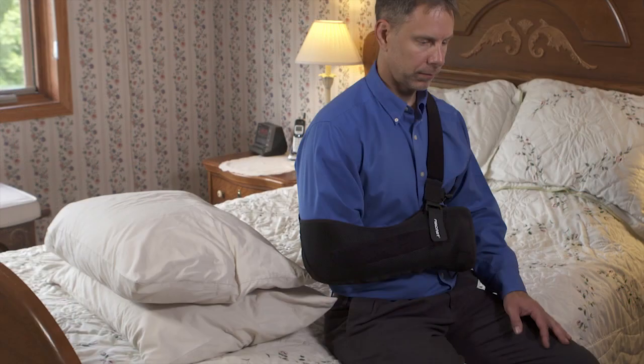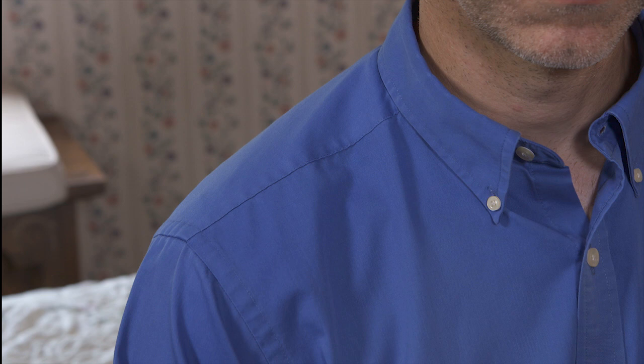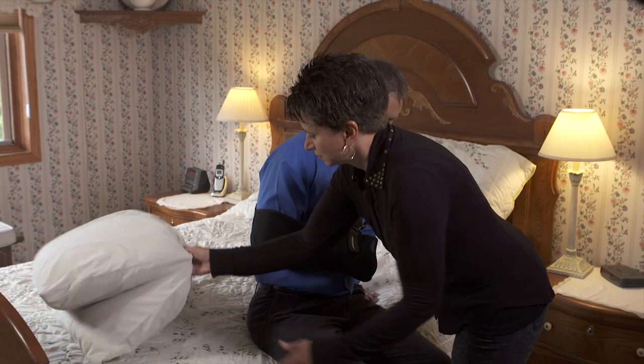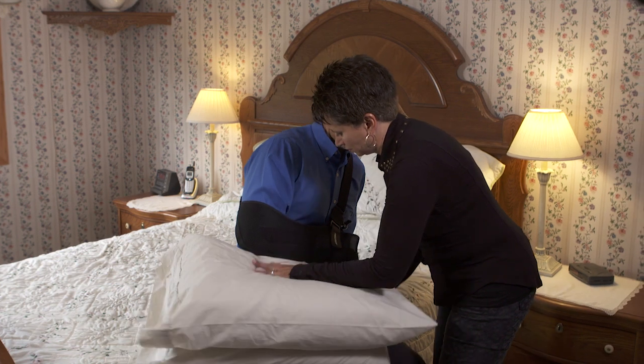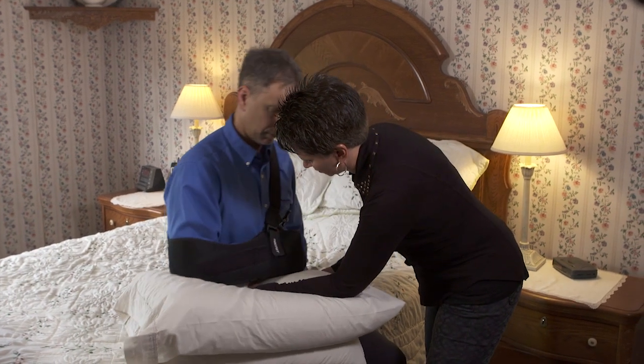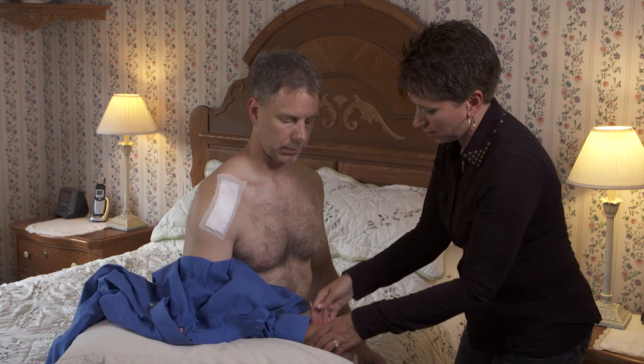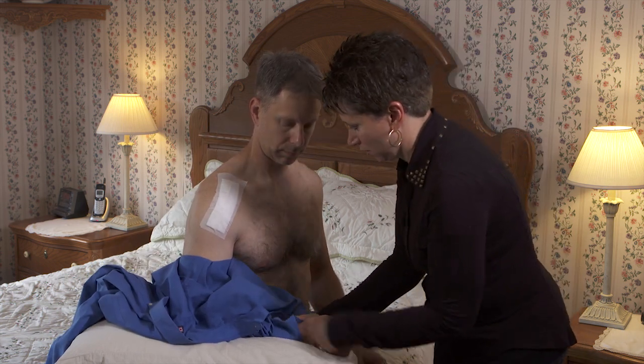When getting ready for a shower, sit on the edge of a bed or couch. It is very important that you do not move your healing shoulder. Have your helper arrange 1 or 2 pillows for your arm to rest on. Lean to the side as your helper puts the pillows in place. Then sit upright to rest your arm on the pillows. Your helper removes your shoulder sling and shirt, as instructed by your healthcare team.